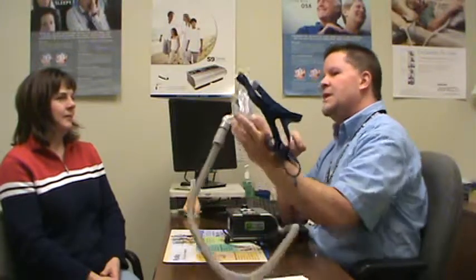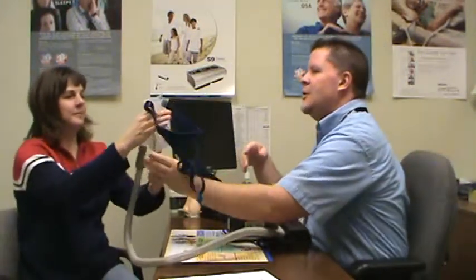So if you start to feel there's too much pressure on the bridge of your nose and start to get skin breakdown and whatnot, you just want to dial that out until you get a little bit of a leak into your eyes, and then you want to dial it back one notch to stop that leak. And that should be a perfect fit, allowing enough pressure down here and not too much pressure up top. I'm going to let you go ahead and fiddle with that for just a moment. Righty-tighty and lefty-loosey. Do you understand the mechanics behind that? Yes, thank you.